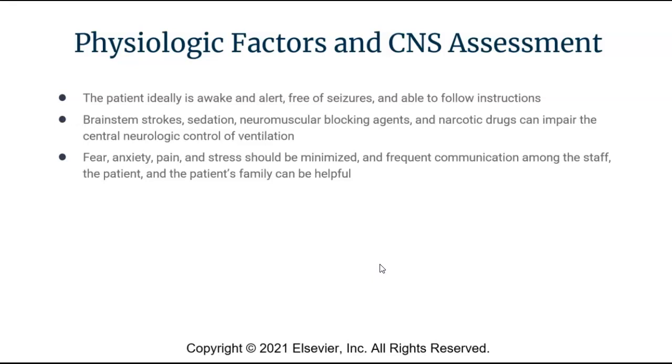I switch them over, and I'm only giving them 5 of pressure support, and that's really, really hard to breathe right out of the gates. And then that just ramps their anxiety up and causes them to breathe really, really fast and really, really shallow, and then they ultimately fail.